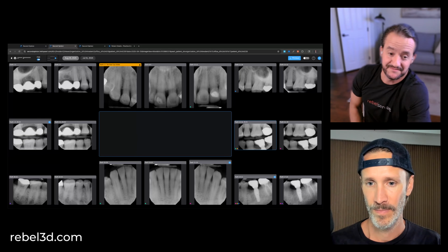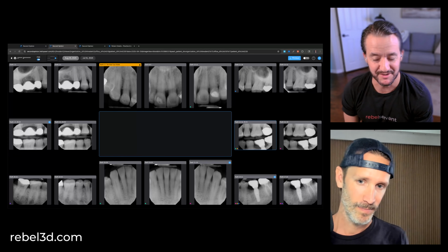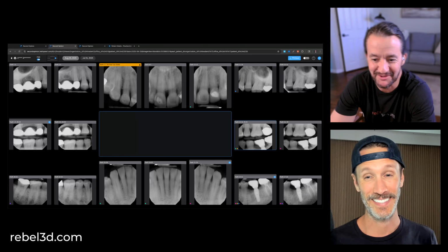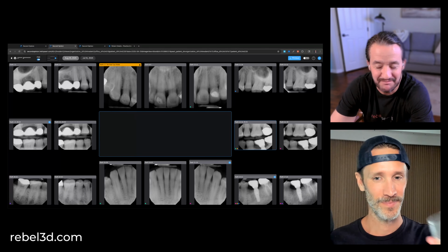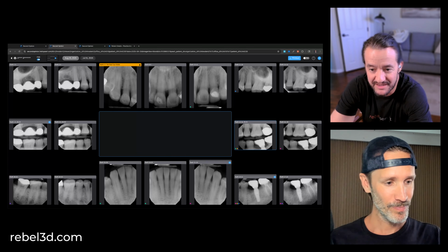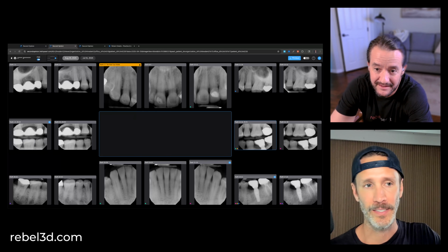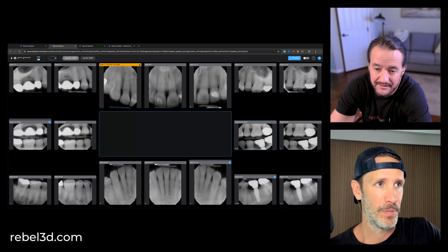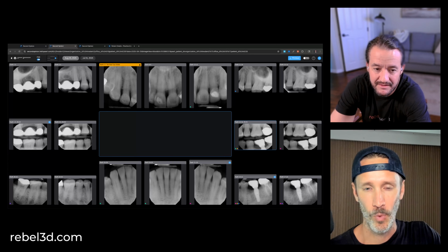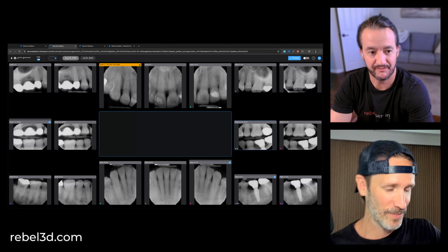Wow, that's awesome. So good. And we could go down the rabbit hole of the insurance game that gets played. We don't want to throw anyone under the bus, but I'm betting having Pearl AI at your back makes it harder for the insurance companies to justify claim rejection. Yeah, again, it's not a guarantee, but it's a tool, just like anything. One more tool in your quiver. One more arrow in your quiver.